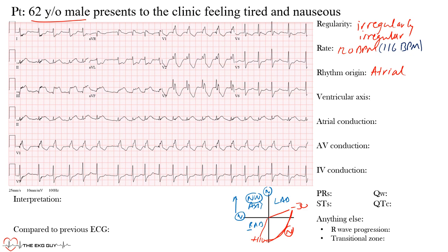To find the axis, we pay attention to lead I sitting at zero degrees and lead aVF at positive 90 degrees. Now let's look at lead I: above and below the baseline are quite similar — maybe even slightly more negative — so it lies somewhere in between the positive and negative poles.